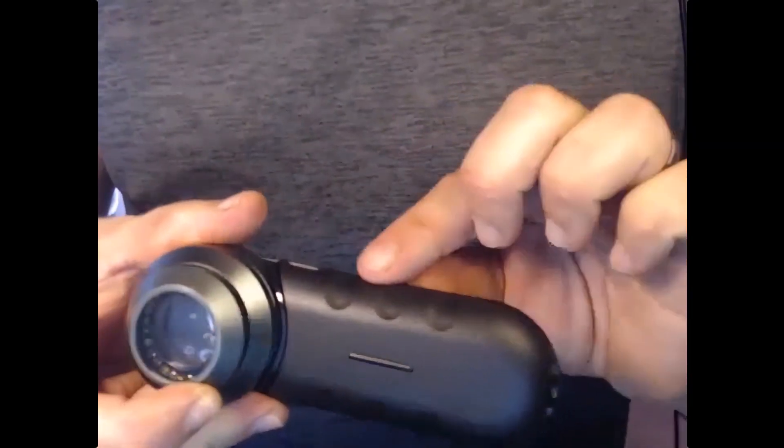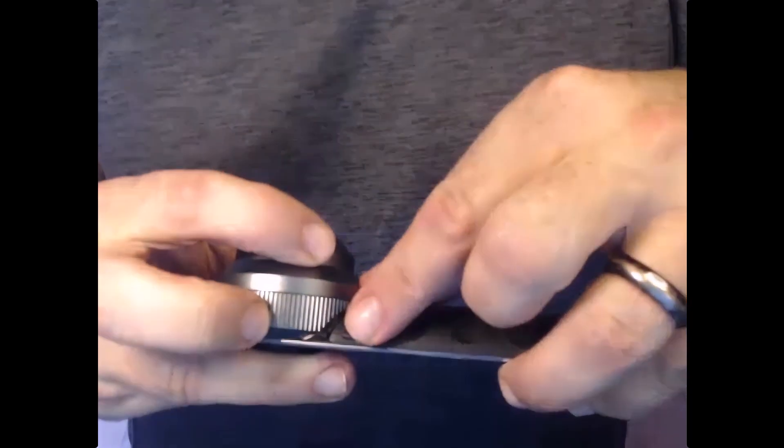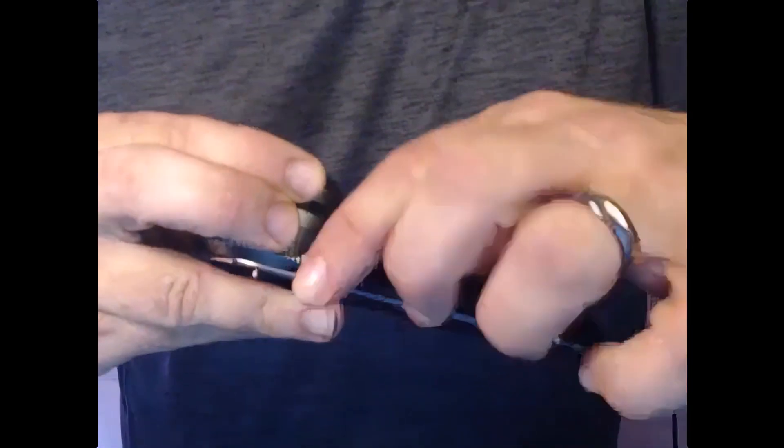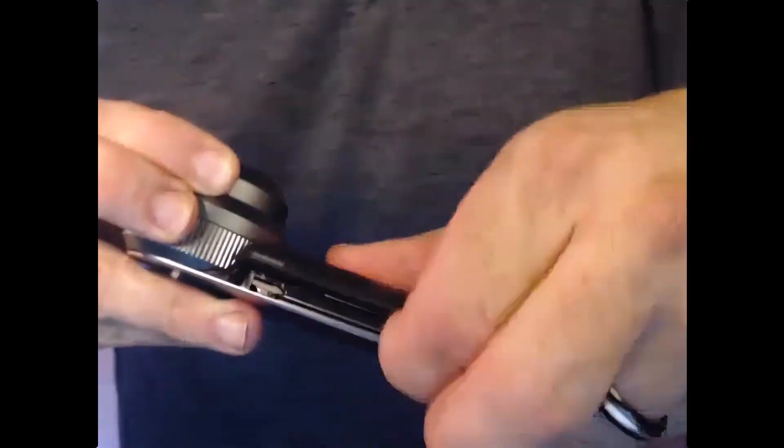Assuming you have one of these rubbery plastic covers, the advantage to them is that they are pliable. So you can go here to the edge and simply pull it up like that. And when you do, it will then allow you to pull it up all the way around like that.